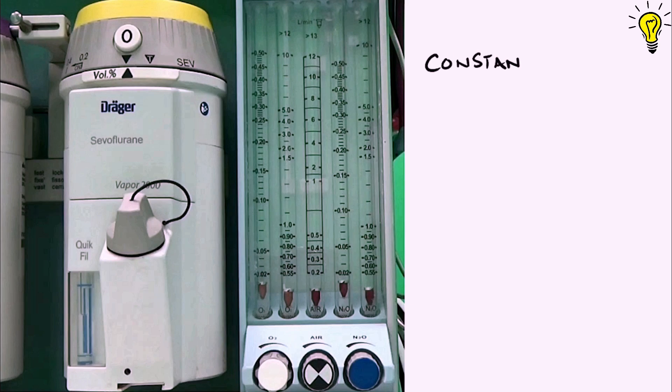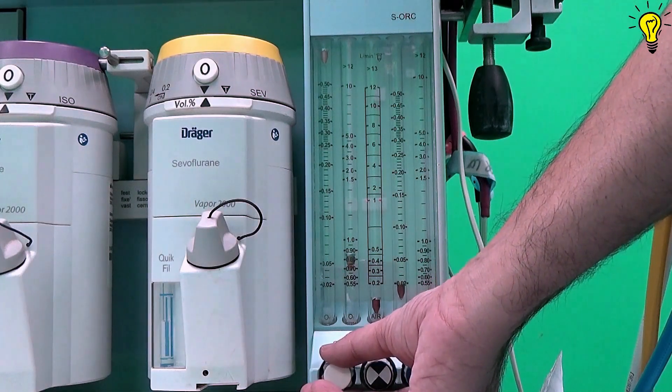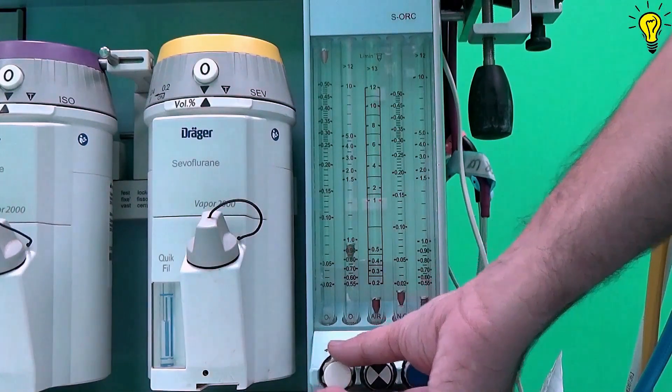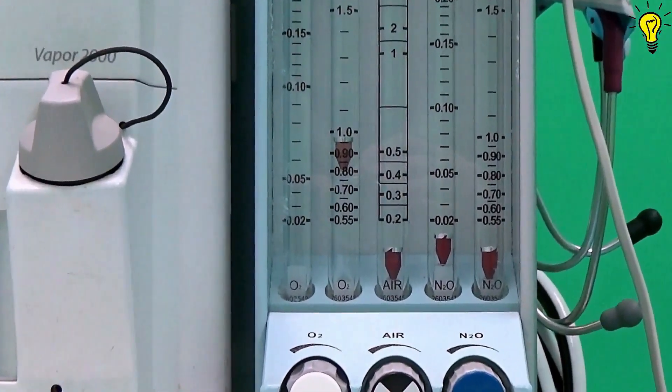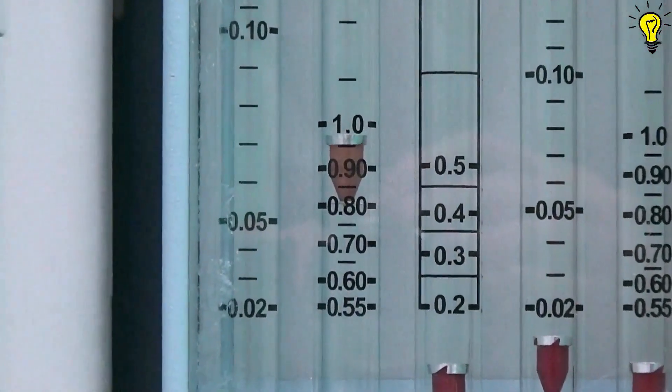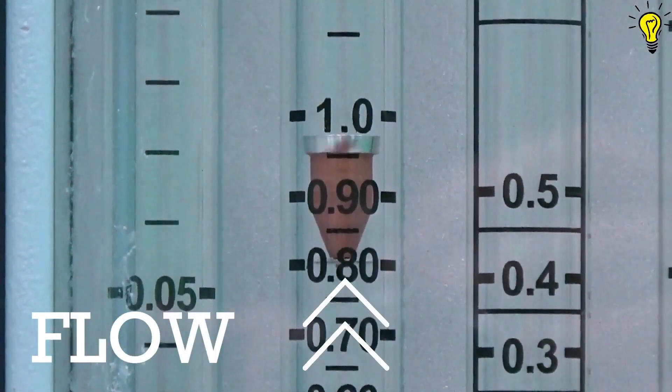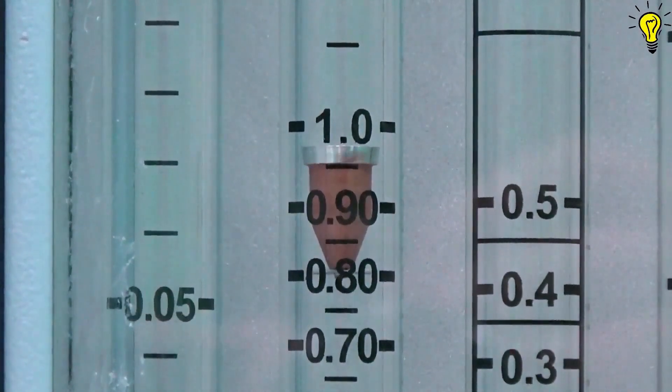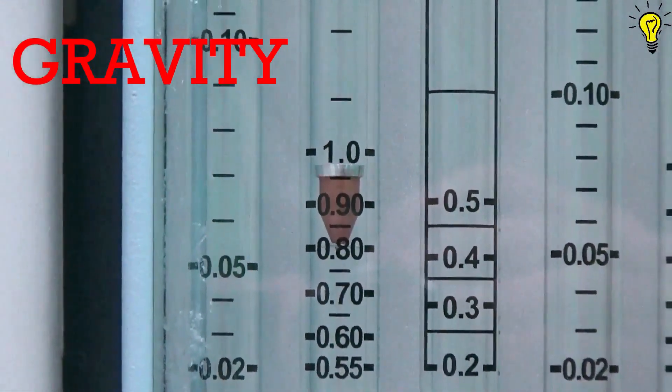Now the second component of flow meter assembly is the rotometer or constant pressure variable orifice flow meter. What do you mean by constant pressure and variable orifice? Let's rotate the knob counterclockwise and open the flow of oxygen. Now you can see the float hanging in the space perfectly in equilibrium at 1 liter per minute flow. So what's keeping this float hanging mid-air? The balance between two forces. The flow is moving the float upwards while the gravity is pulling it downwards. So the float hangs wherever the two opposing forces balance each other out.